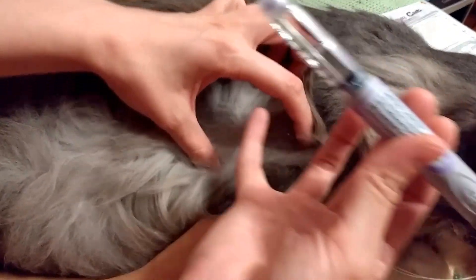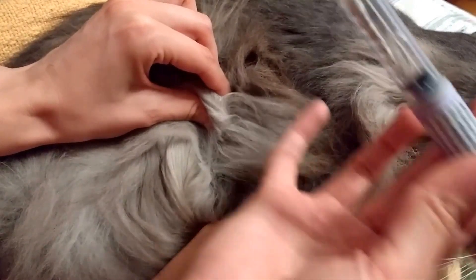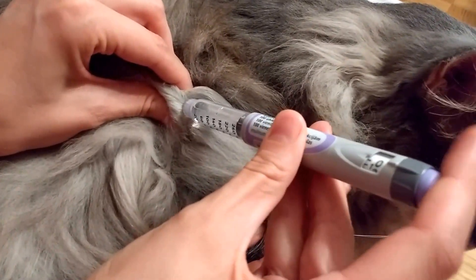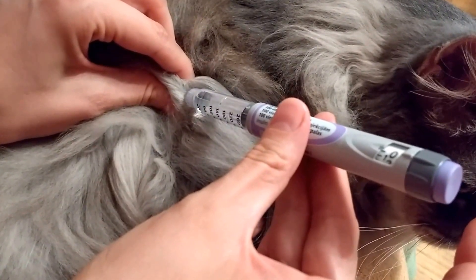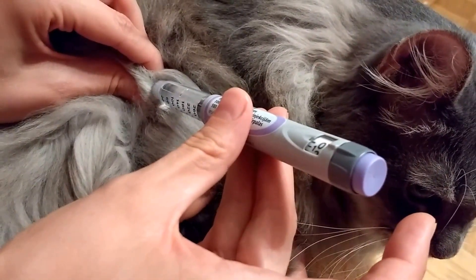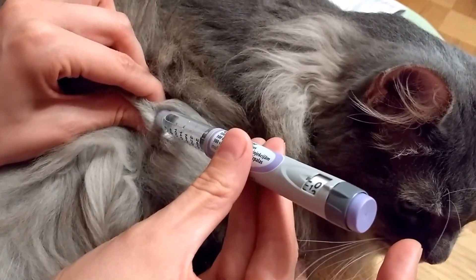I'm trying to pull the hair away and grab his fat. Then I'm going to poke him, press on the purple, and hold it for 10 seconds. Make sure to hold it.